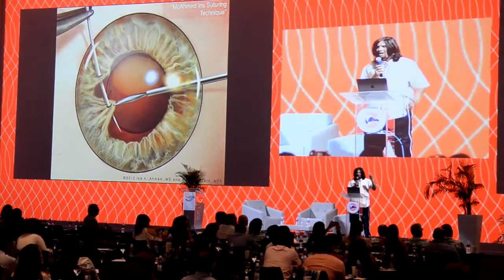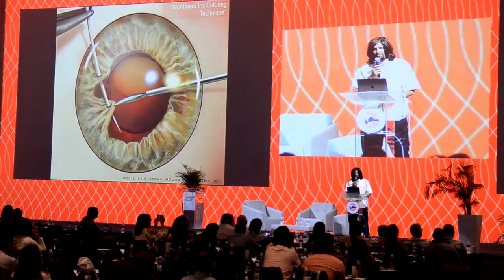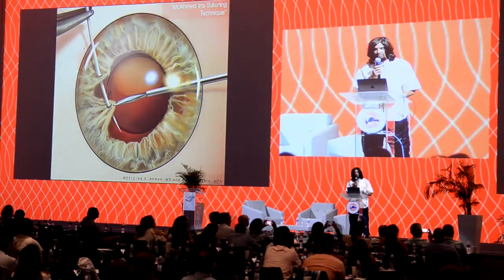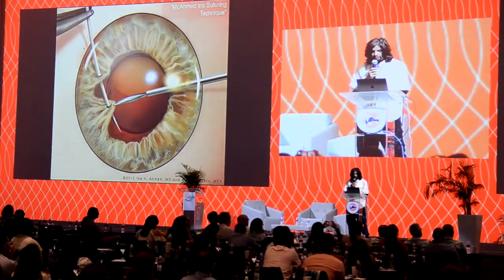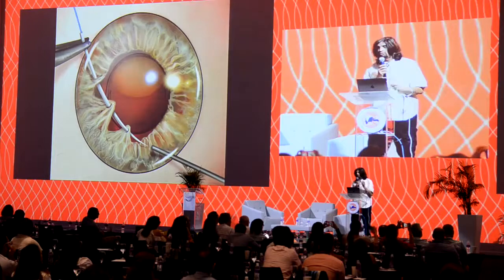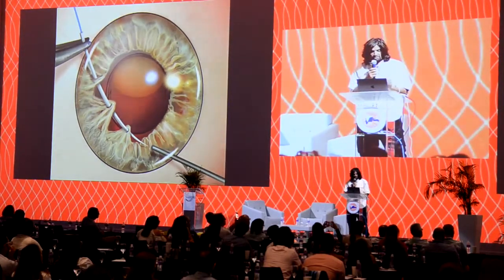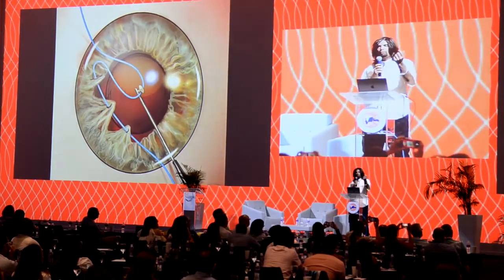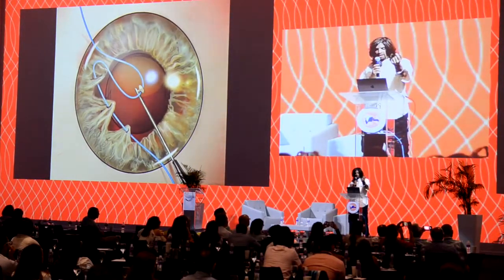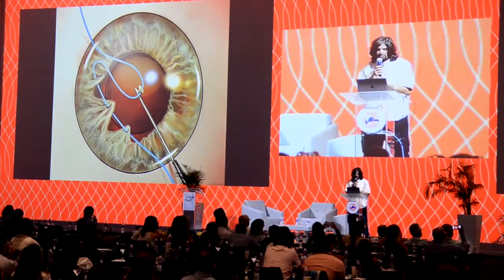Basically, you'll see it's pretty simple. We pass the needle through the iris defect area. Notice that the paracentesis is made away from the area. We don't want to make it here. We want to make sure we can pass the needle nicely, a nice gentle pass. We then come out assisted with a docking cannula to avoid trapping the needle in the cornea. Then take a Kuglen hook and pull both of the ends out to the main incision. The incision should be about 1.5 to 2 millimeters.